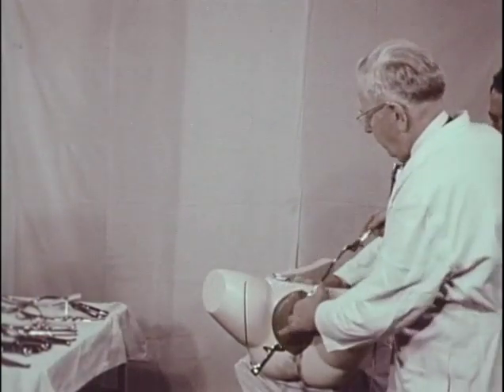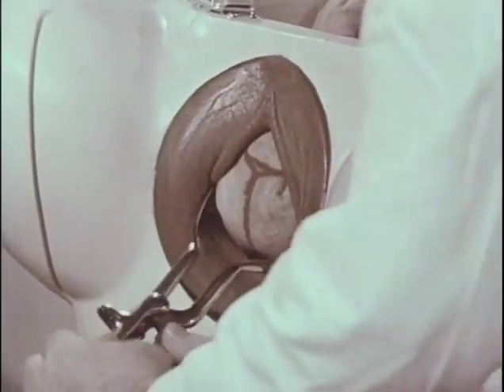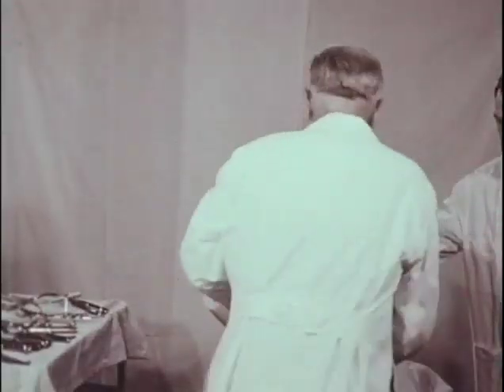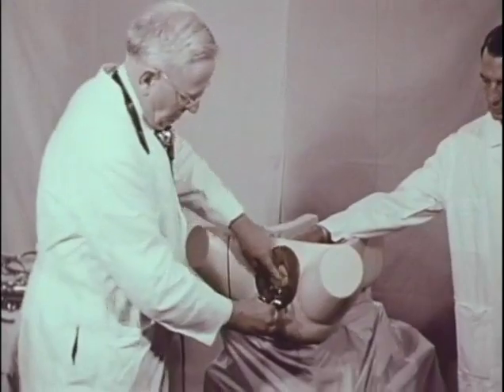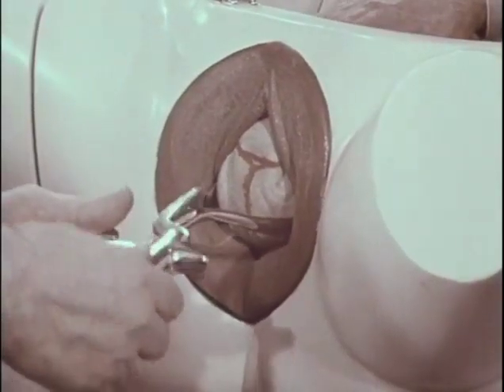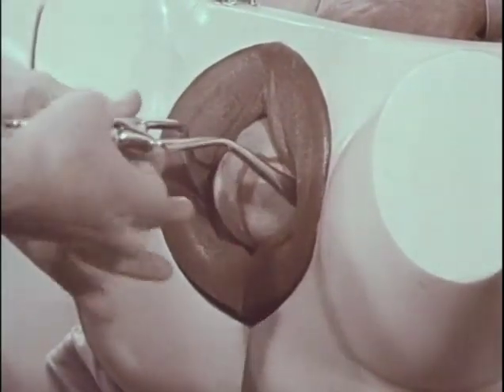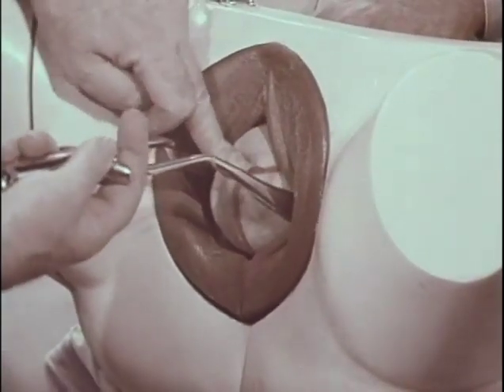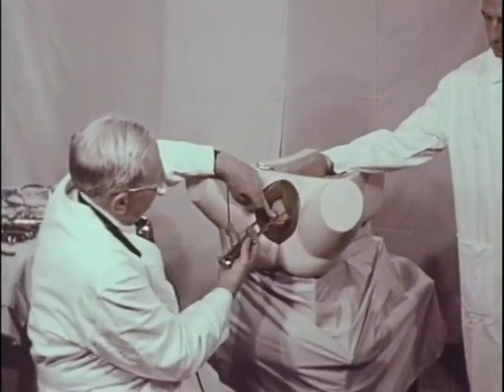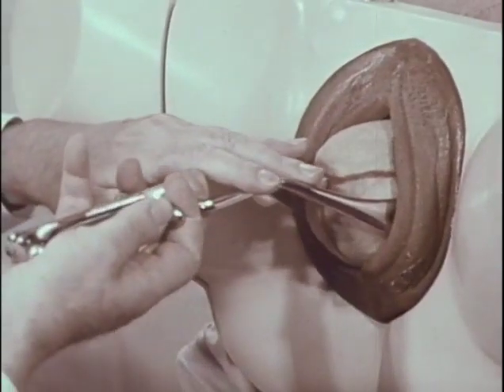Then the anterior blade, the right blade. Check our application. The fontanelle is slightly more than a finger's breadth above the plane of the shanks, so we correct that by elevating the handles one at a time, relocking. Sit down, proceed with traction.